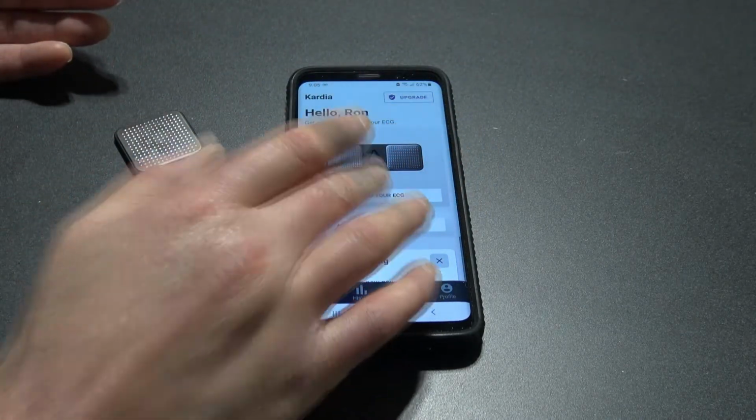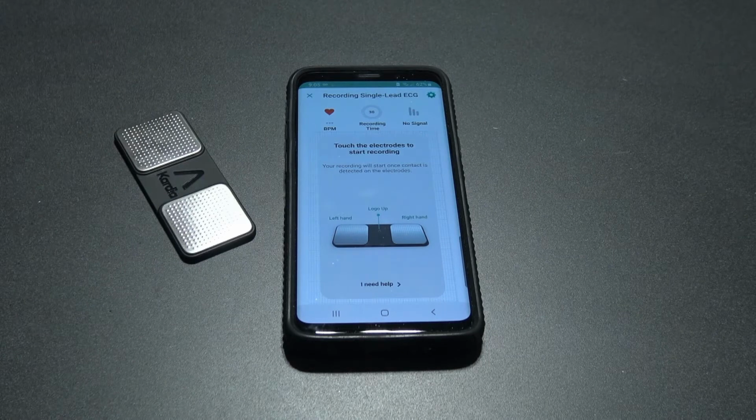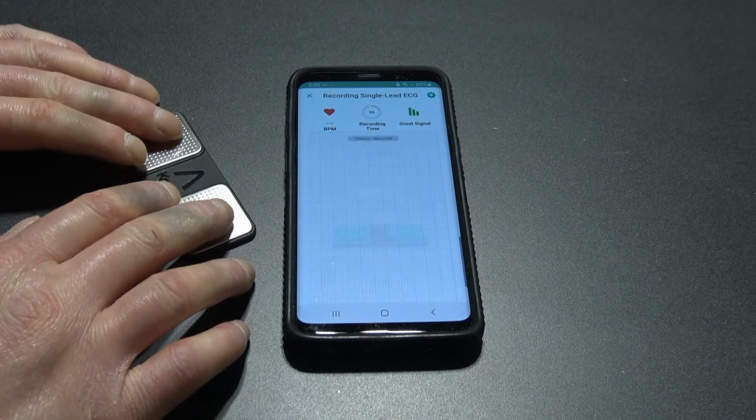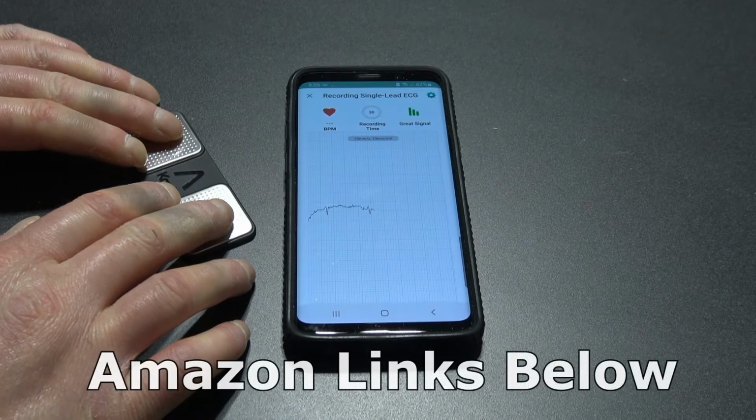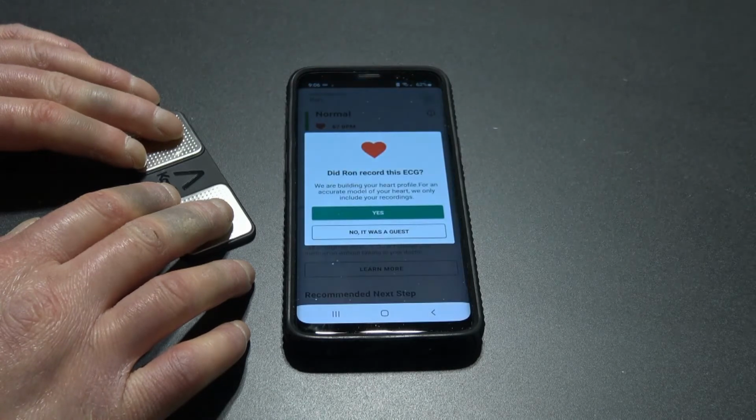So let's take a recording. And keep relaxed. Don't talk. And just keep your arms still. Let's go. Good reading.